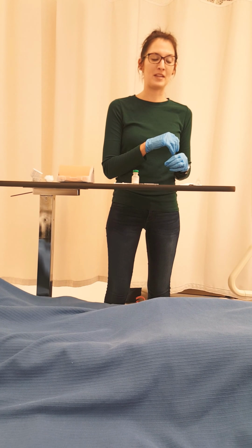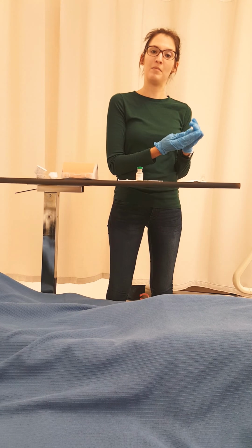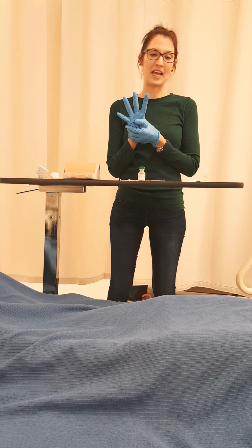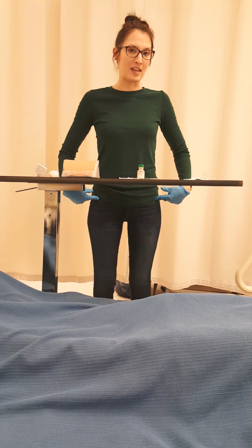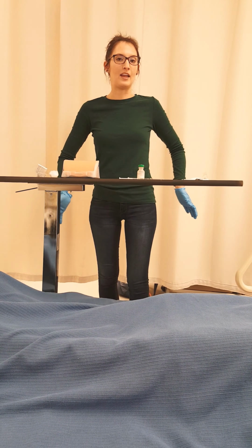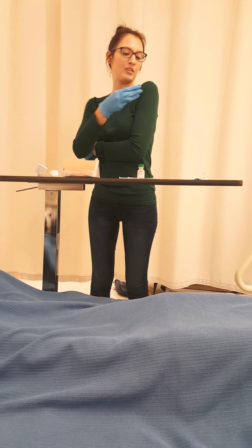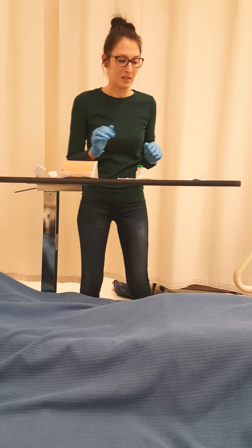Once we get to our patient's bedside, I'm going to wash my hands and introduce myself to the patient. I'm going to explain to them that I've gotten an order from their doctor for an IM injection, and I'm going to explain to them the 4 sites that they can choose from for this injection. There's the deltoid, there's the vastus lateralis, there is the dorsal gluteal, and the ventral gluteal. They have chosen the deltoid, which is 3 fingers down from your acromion process is how you find your injection site.